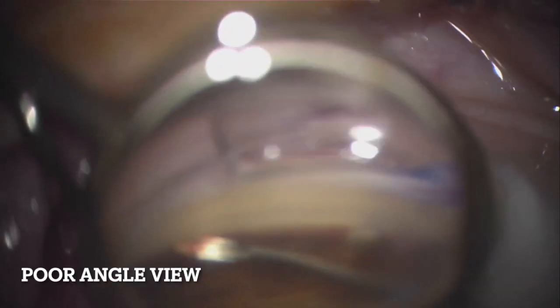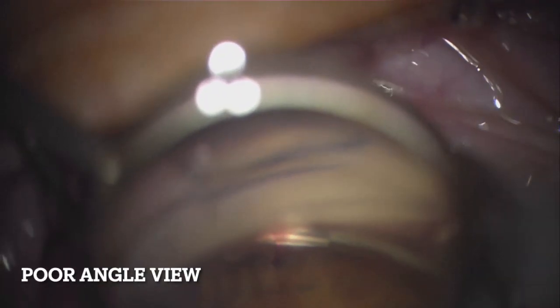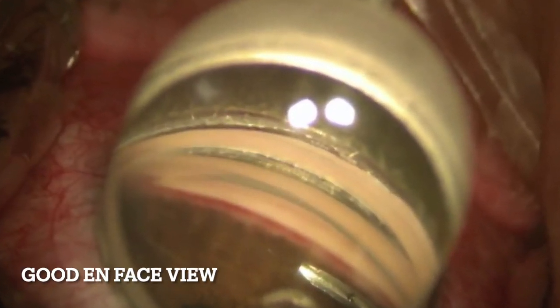One of the most common challenges seen with MIGS in general is having a poor angle view during surgery. The fundamentals begin with knowing what is a good on-face view, seen here, where all angle structures are in great front view. A poor view is a top-down view of the ideal entry site, which doesn't allow for the full visualization of the angle anatomy.